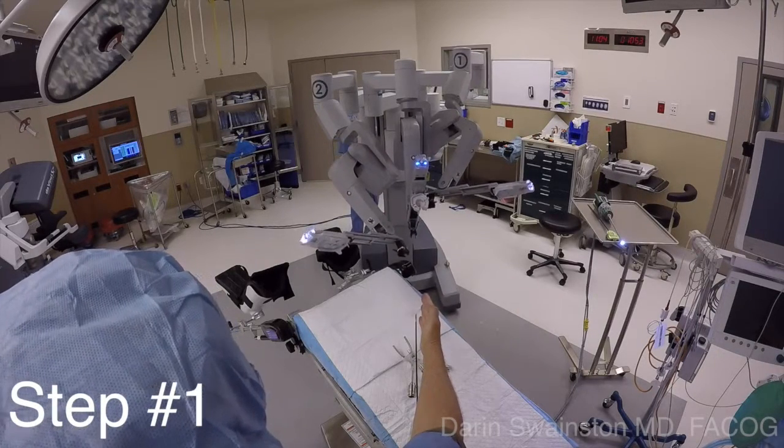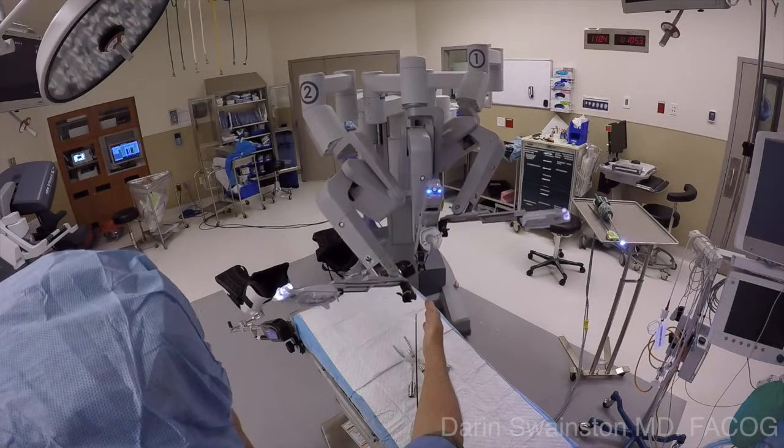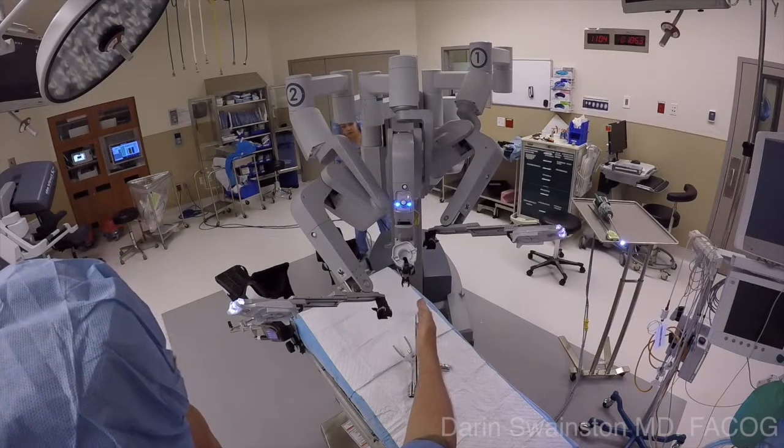While doing a side dock for single-site hysterectomy, step one is to line up the shoulder through the single-site port. This helps the person driving the cart so they know the right angle to come in. This is very important to show them.